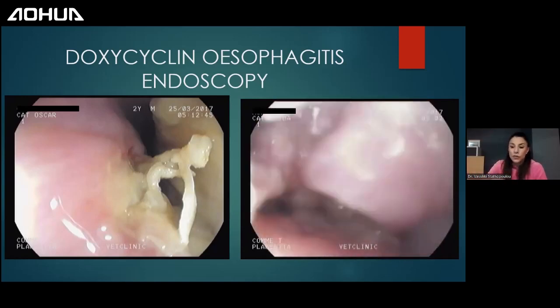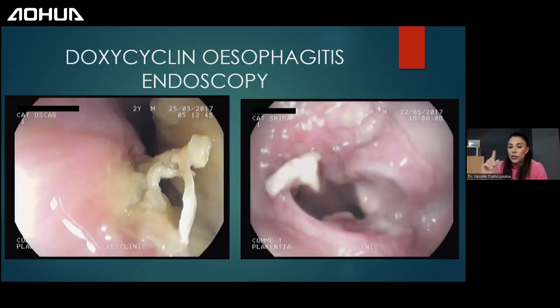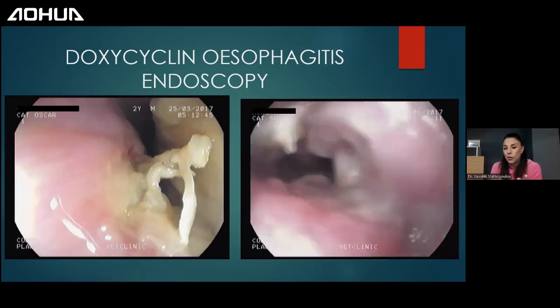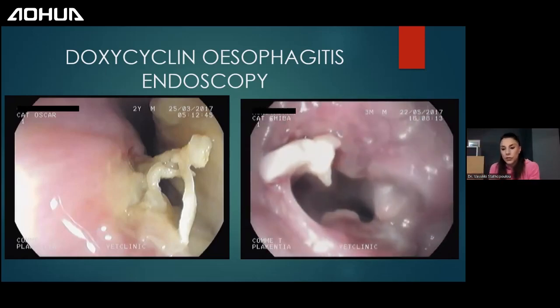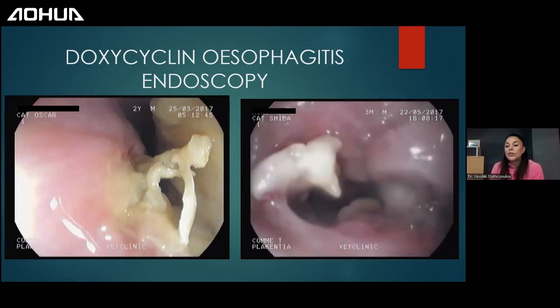And if you have a colonoscope, a bigger diameter scope, and not just one scope, because this was a small kitten, we used the bronchoscope. And then I went with the 8mm scope and opened it a bit wider so that it can stay.